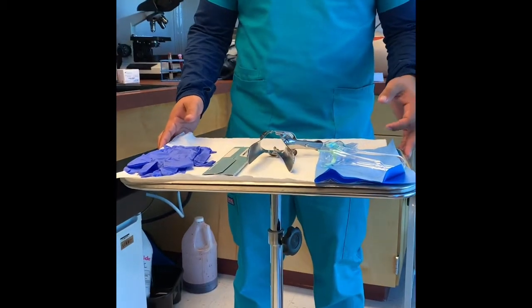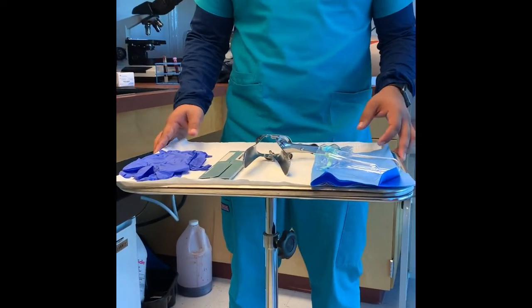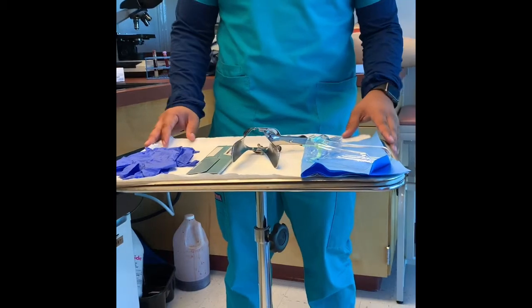Hello, good afternoon. Today I'll be showing you how to prepare for a gynecological exam, also known as a pap smear.